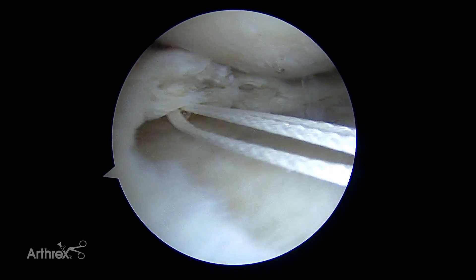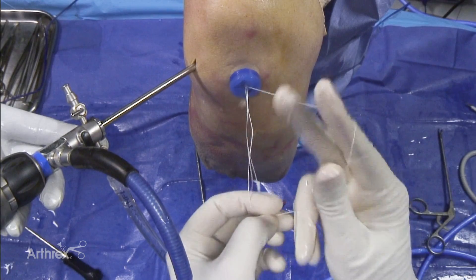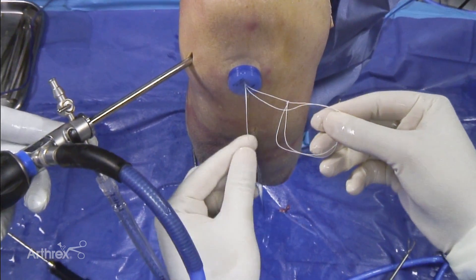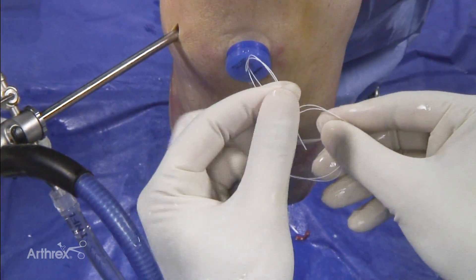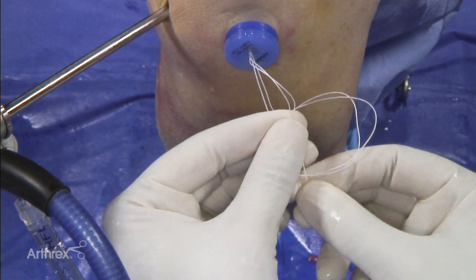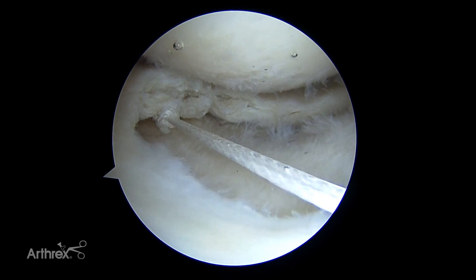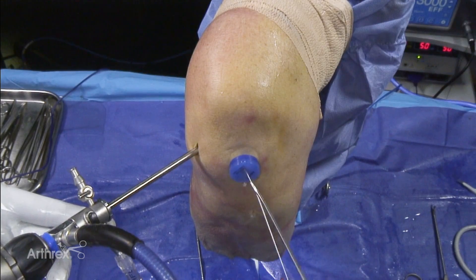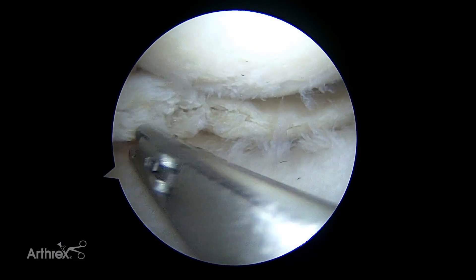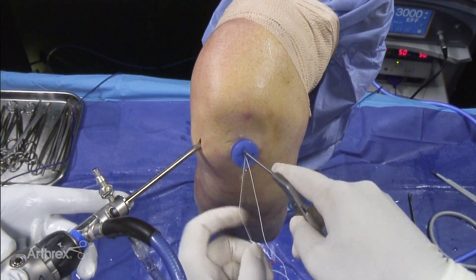Now we're going to tie a little rack hitch. I'm going to take the loop end of the fiber wire and create a little rack like this — I've got this opening here. Now I'm going to take these free sutures and pass them through the opening, and as I pull this down it creates my knot. I'm going to slide that down using the reusable knot pusher cutter, pulling on each limb to really get it secured.